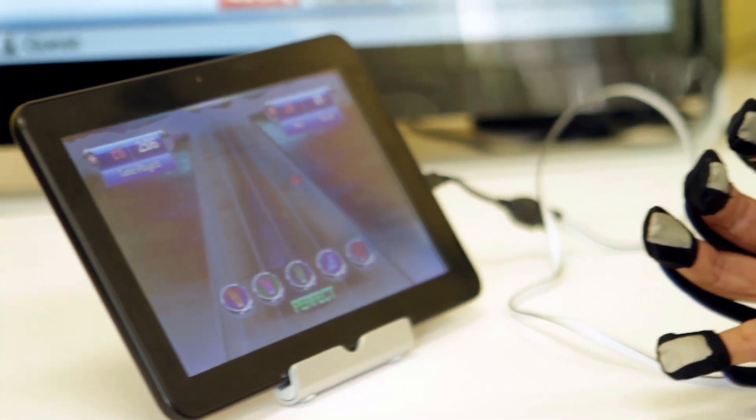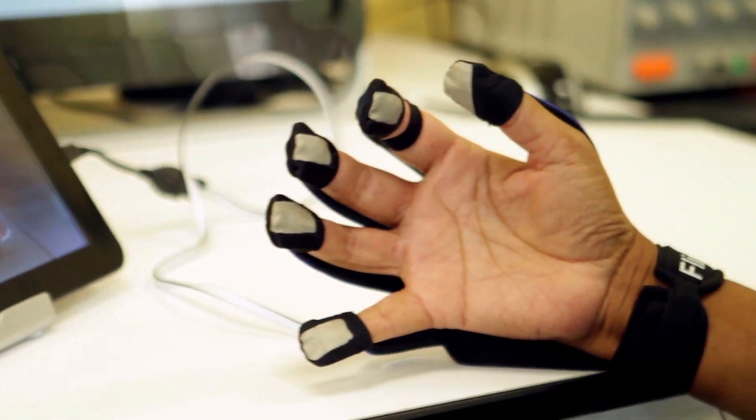It was going to improve my brain's ability to selectively move my fingers. It was fun to do, so that meant you didn't feel like you were working. I don't use computers, but it was a piece of cake.